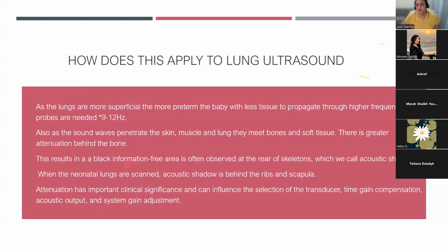And the reason why it's not easy, again, is because the baby arches. The more he arches, the more you press, you cause more pain, and your image quality actually deteriorates. So when you hold the probe, it should be very light. It should be in contact. I'm just dropping my phone, as you can see in the hand over here. There should be contact. There shouldn't be pressure, because the more pressure you put, the more the baby will arch his back.